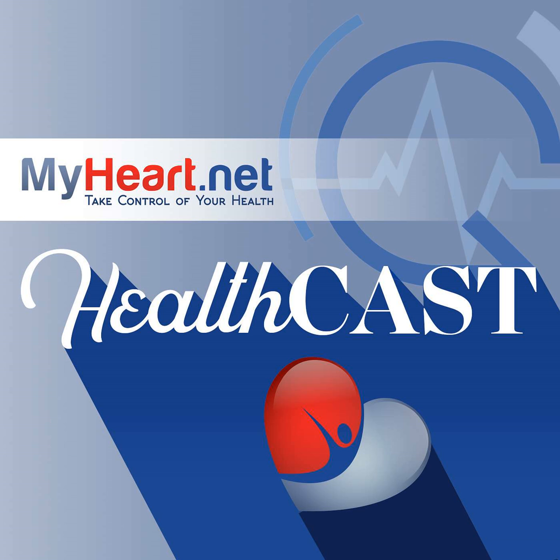Right. Well, I feel like that's probably the way we're going. That's the way of the future, where you have a non-invasive technique like a cardiac CTA, particularly combined with FFR, where you could really streamline the treatment of a particular patient, and bring someone to the cath lab where you have increased certainty that they may need a beneficial intervention. Otherwise, we treat medically, and you can really prevent all this utilization of cardiac cath.